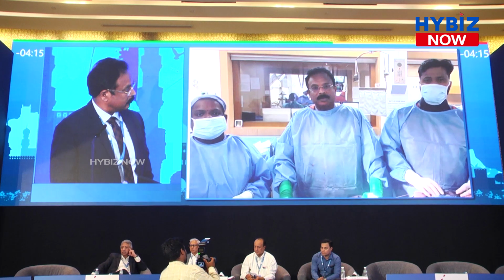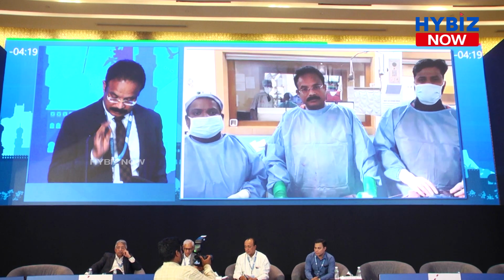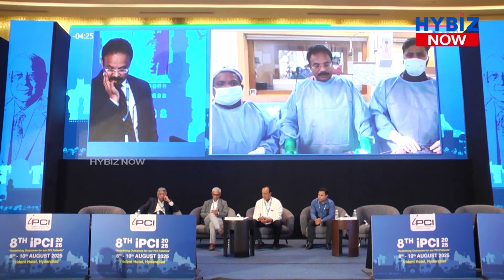From DC Hospital, Cochin, we are presenting a case of OCT guided PCI in a case of acute coronary syndrome. Today, I am joined by my colleagues, Dr. Anish, Dr. Vijin, Mr. Anu, our senior cath lab technician, Mr. Joshi, who is handling the OCT, Sister Ivy, and Sister Angela.